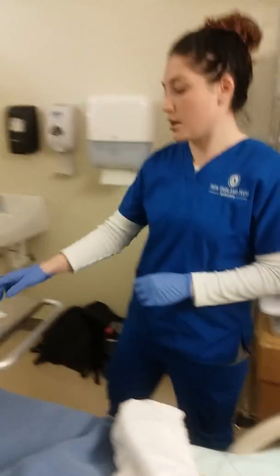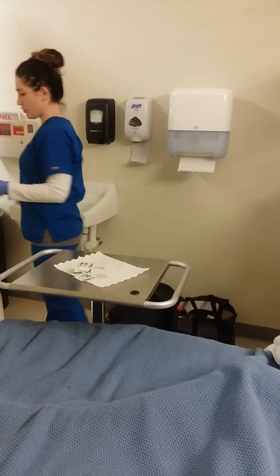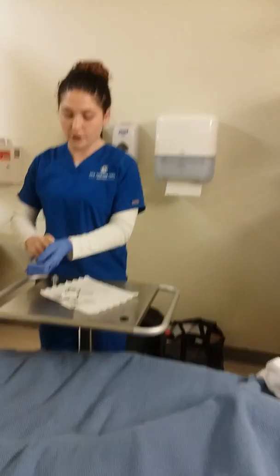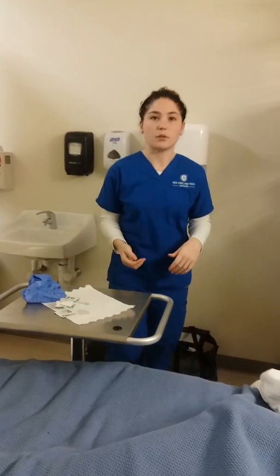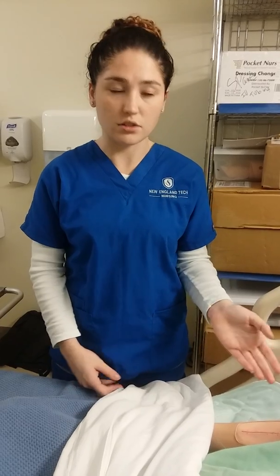I then would discard of my syringe into the sharps container as appropriate. I would remove my PPE, my gloves, and perform proper hand hygiene. At this time, I would make sure to document the administration of this medication immediately after giving it, and then I would evaluate my patient for any reactions to the medication.